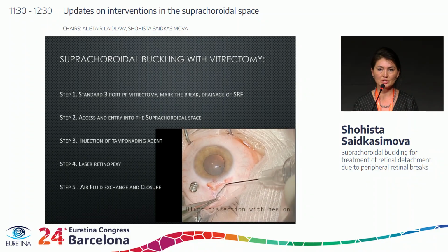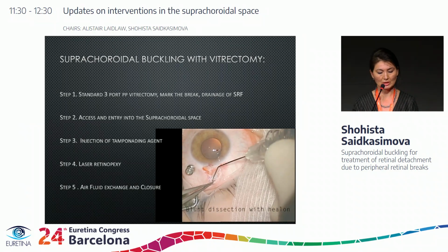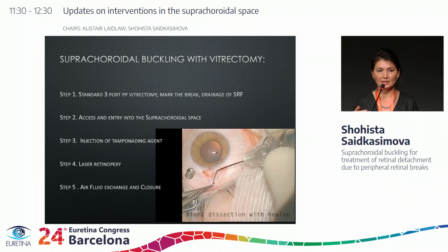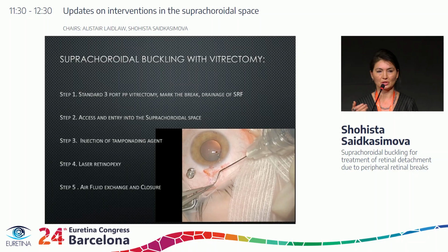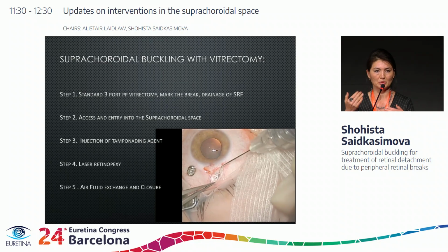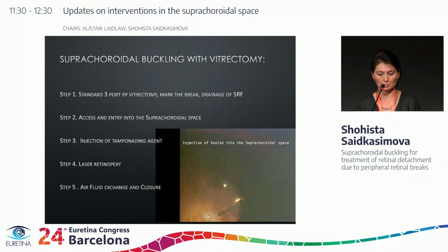And also we're treating peripheral retinal breaks, which are usually in the pre-equatorial area and easily accessible with just a small advancement. It's also quite nice to enter the suprachoroidal space slightly ahead of the break itself, because if there's any injury to the choroid, it's not under the break, it's a bit more advanced, a bit more forgiving, so you can still advance towards the break and preserve the suprachoroidal space.